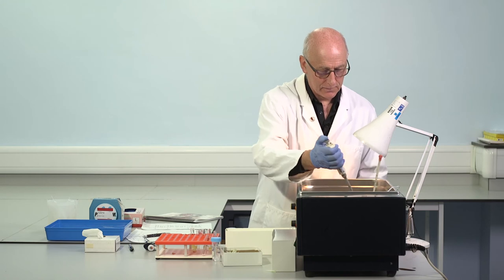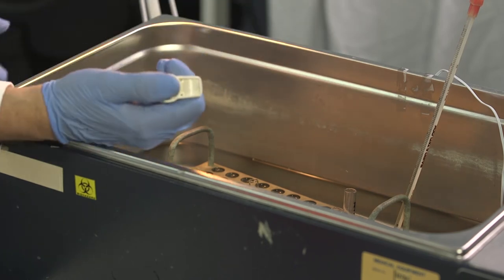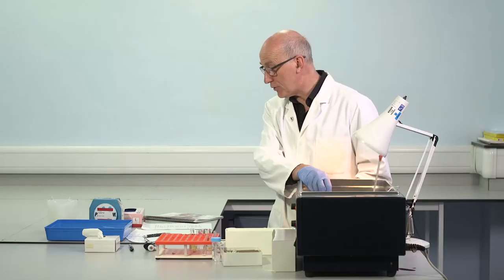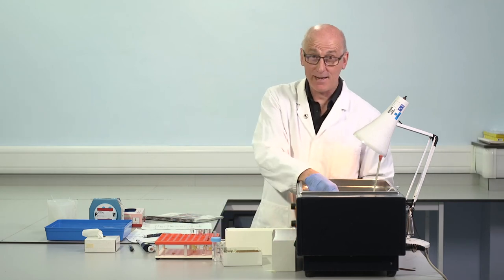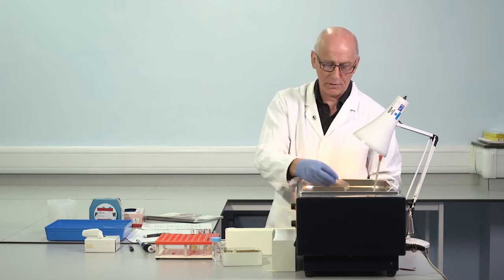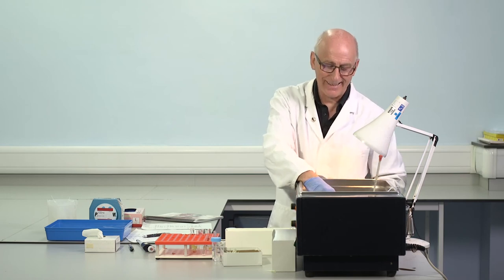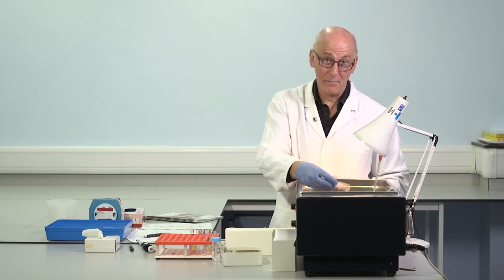3 minutes, and calcium to the first. Calcium to the second. Patient number two. If you remember, APTT 116, 113. So a pretty grossly prolonged APTT. For most reagents, and certainly for this one, that would be a result indicative, if it were a deficiency, of really quite a low level, probably a missing clotting factor.